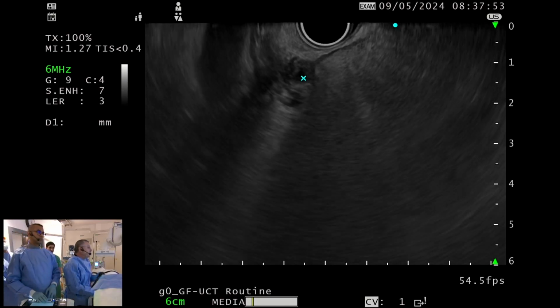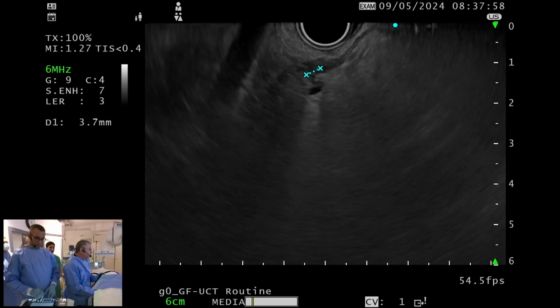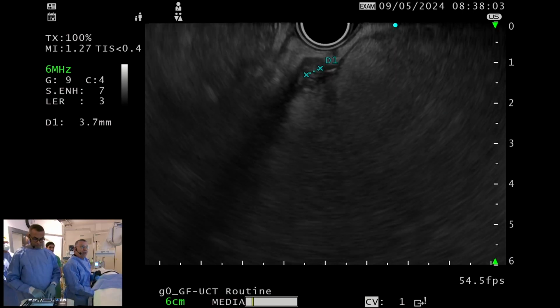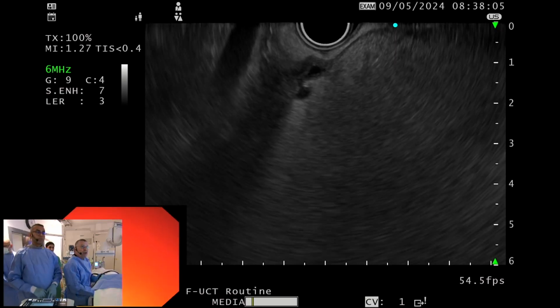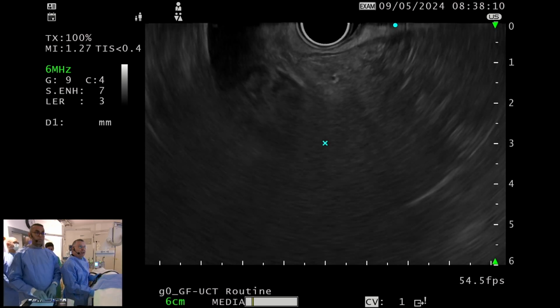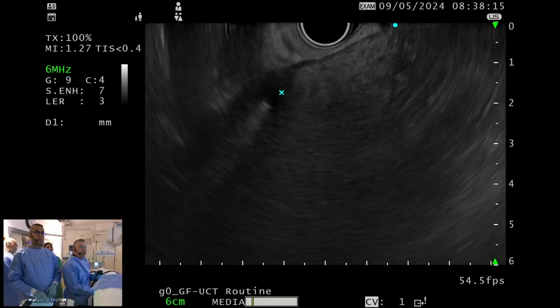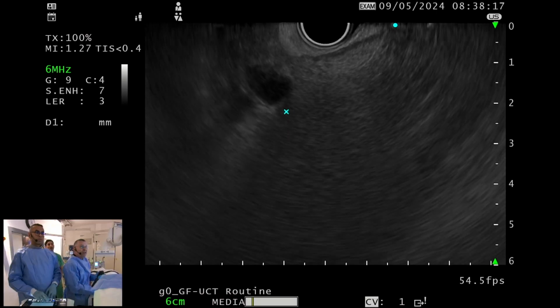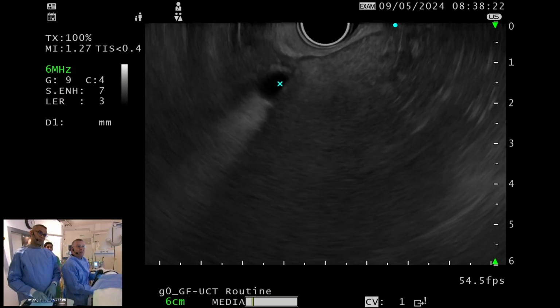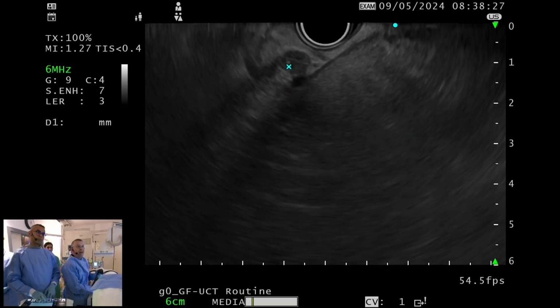And finally, the main thing is that you have the combination of no cholestasis, and normal EUS, and also, and I will show you immediately after, a normal papilla, because with EUS, you cannot see very well the papillary lesion. So you can miss. Here you see the duct is less big than it was, you see? Because the bile has moved into the duodenum.